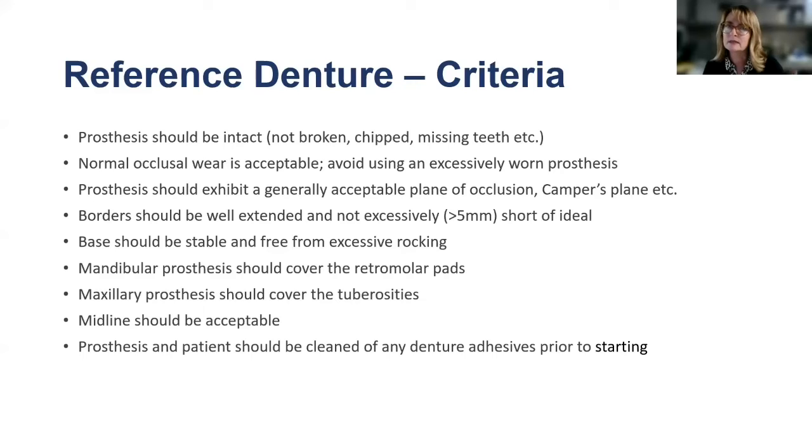What's nice about this process is the patient never has to be without their denture. And you as a clinician don't have to worry about trying to pour any models with the denture in place that day in your office.